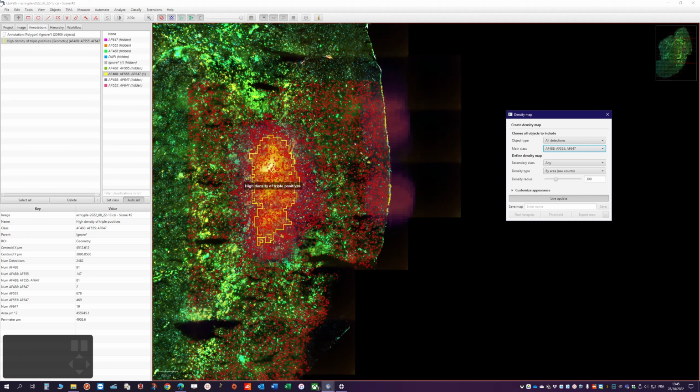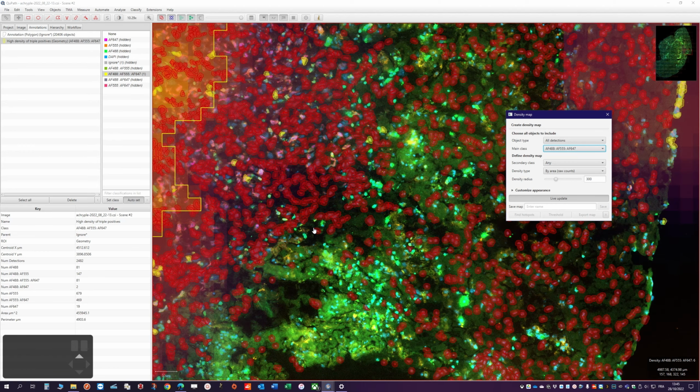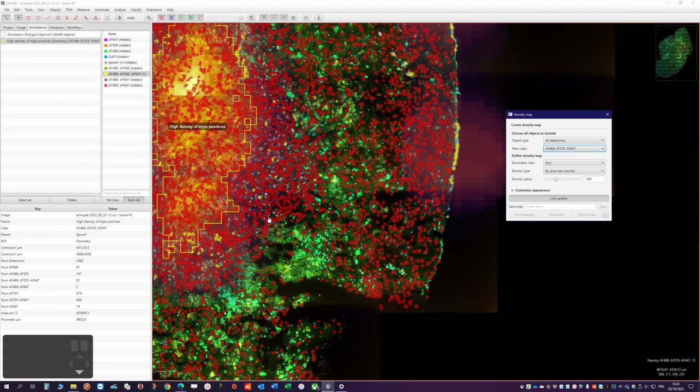Hello, welcome to this new video on QuPath. So recently a user asked me to identify cells that are positive in green, red, and maybe another channel. So basically multiplexed analysis.